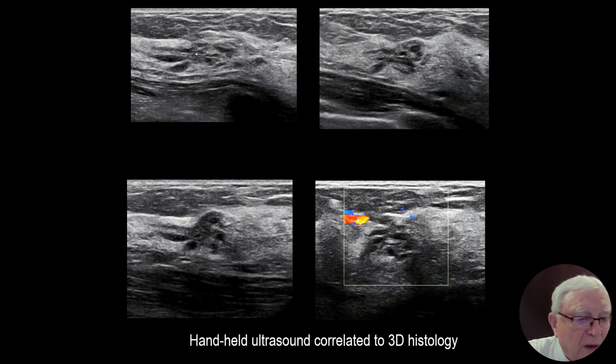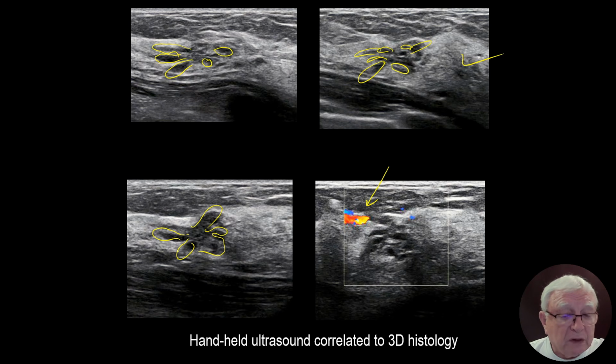Dear colleagues, this is a duct. This is a duct. This is a duct. Small cyst. Does this look like a BCMO, diffusely invasive lobular carcinoma? Absolutely not. Is this a little bit hungry? Yeah, sure. Hyperplastic breast changes need blood supply because they have metabolism.